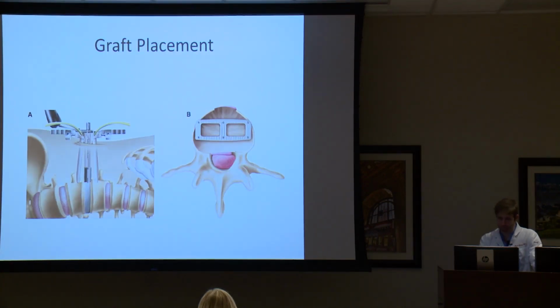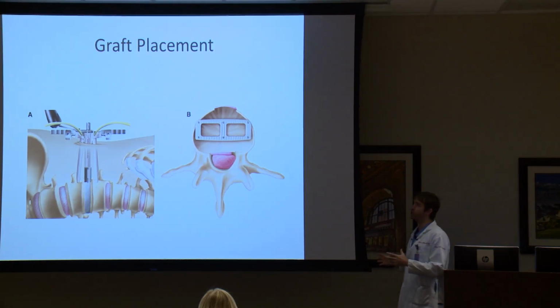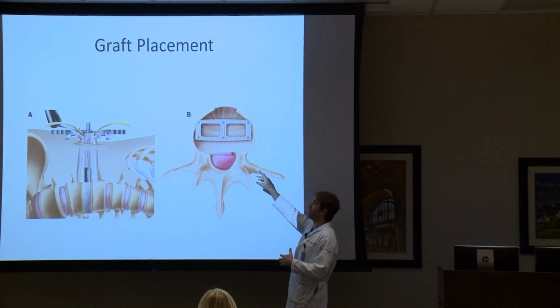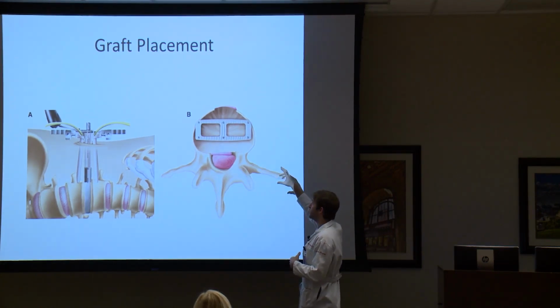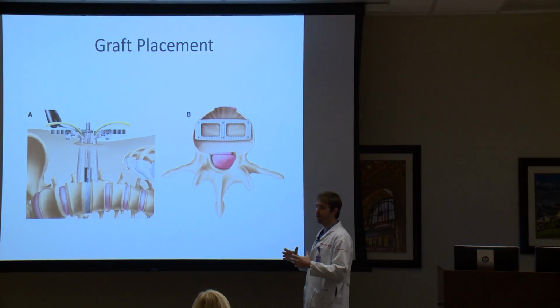rough them up a little bit, and then you try different size cages. The picture you can see over here on the right is what those cages typically look like. See how big that is? That's huge in size. It takes up the entire width of the disc space and about two-thirds of the depth. So that bony fusion mass is now triple what you can easily get doing something from the back.